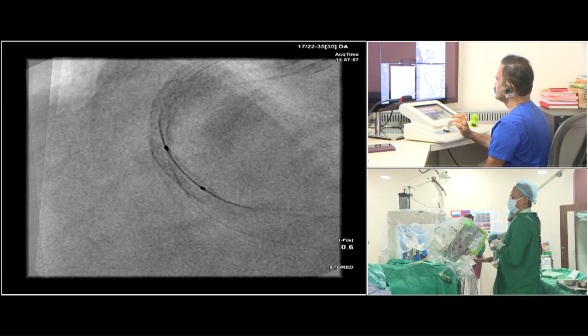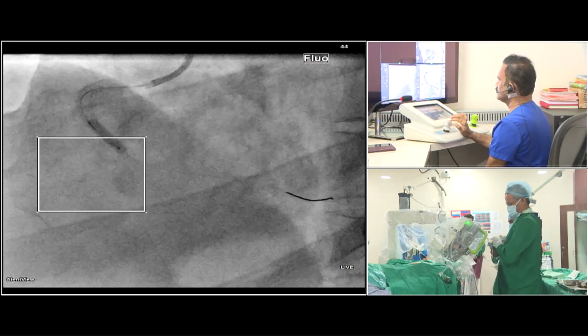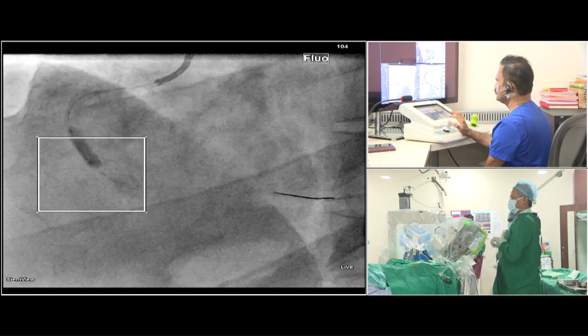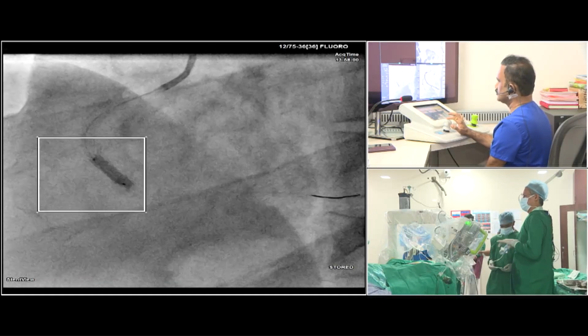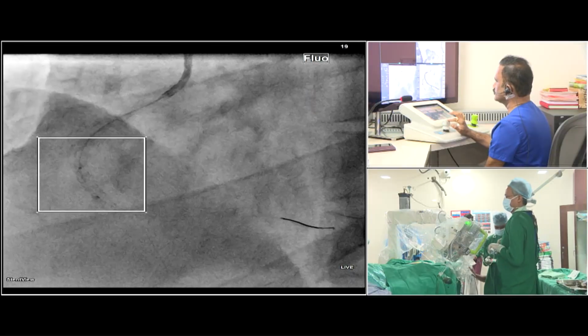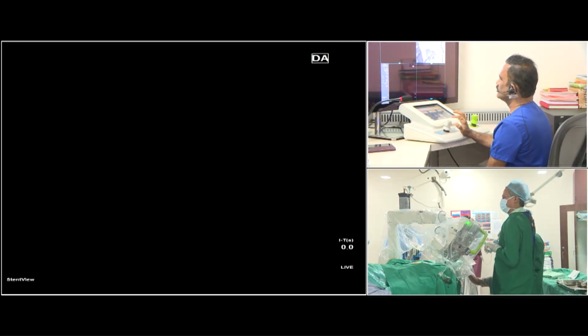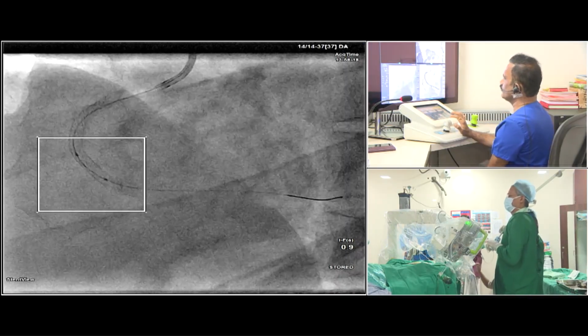Fine, I'm going up, sir. Yeah, so going up to the nominal pressures, 12, 18. It's 14 now, 15, okay. 16. I'm down. Just check distally. So it's 10, boost again. Yeah, we can go for 12.